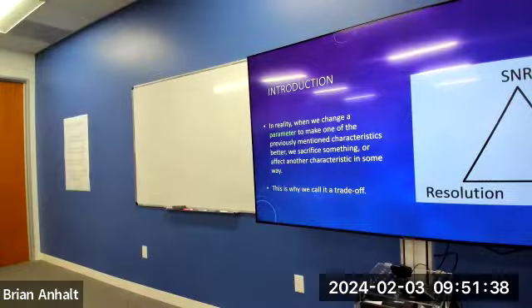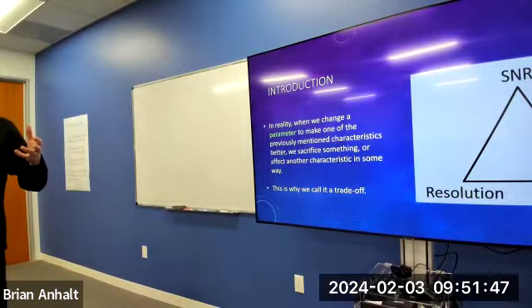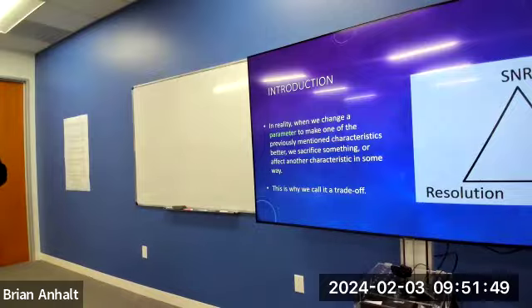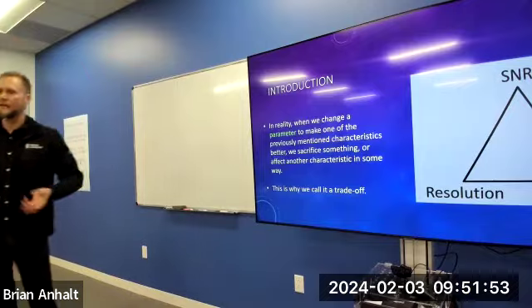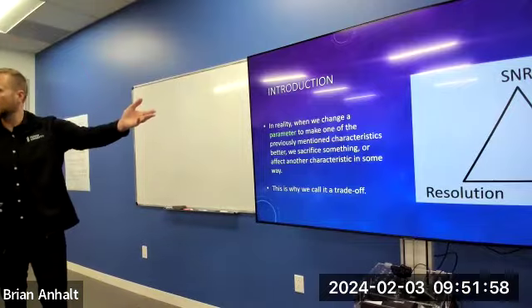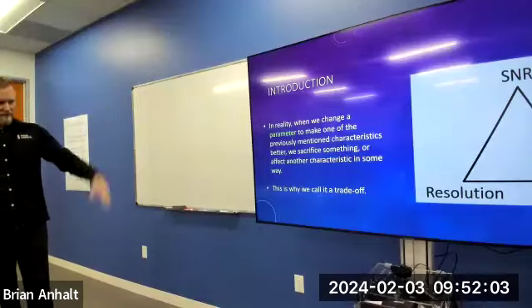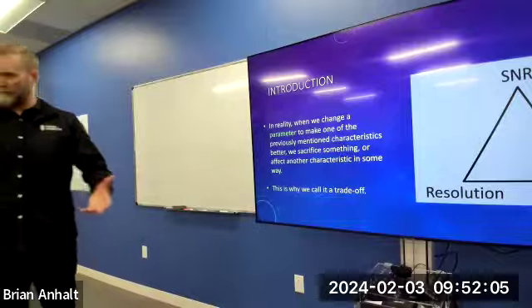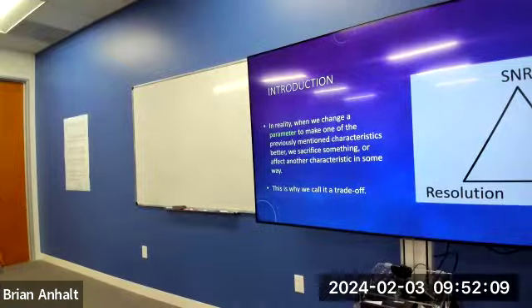I'm going to start putting these things in families for you, because some of it's memorization, right? Hopefully you'll start to understand what happens when we wait longer to collect the echo, that's the long TE. What's happening there? What are the mechanisms behind it? So you can start to visualize, oh, I'm getting more dephasing, so maybe my SNR will go down because there's more dephasing, right? So it's not just memory, it's conceptualizing what's going on to help you memorize, or help you understand what's happening.